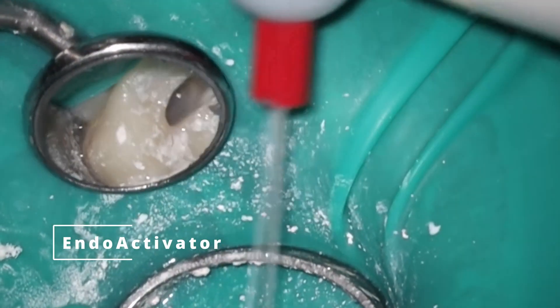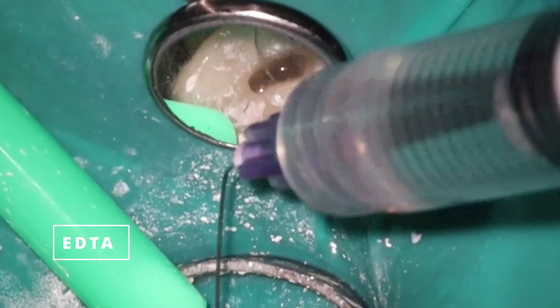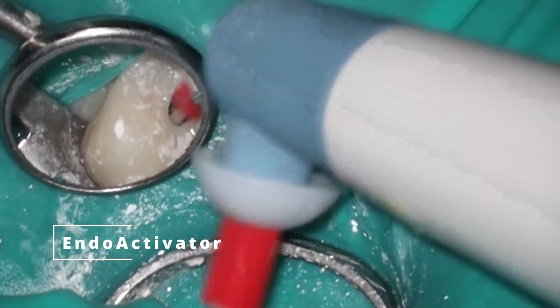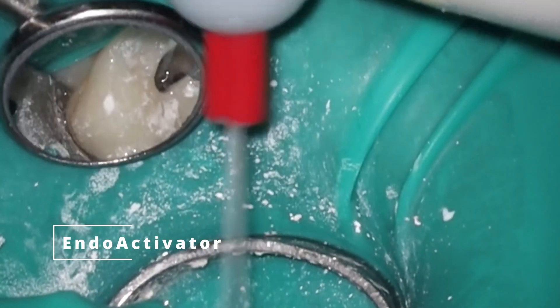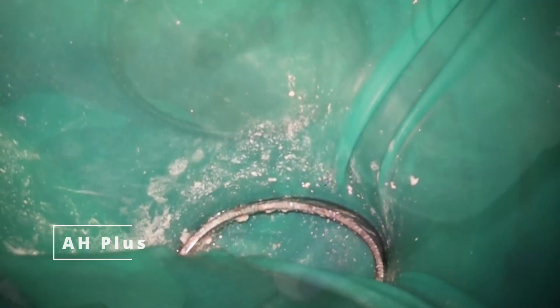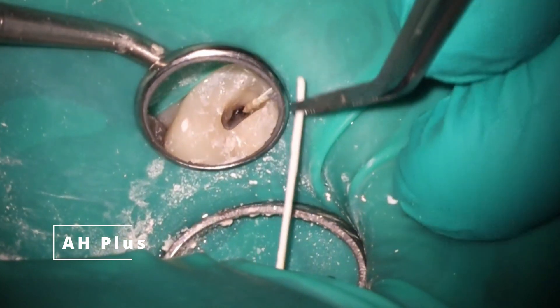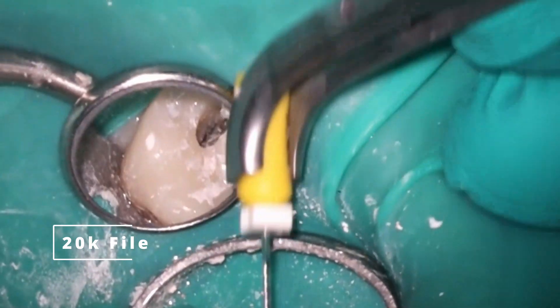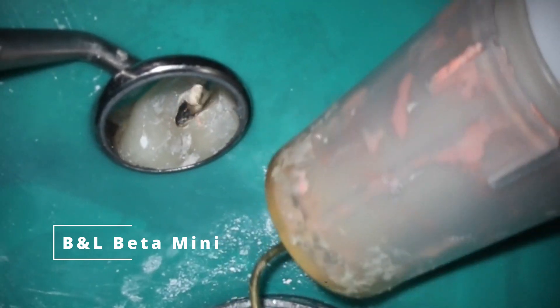So now we're doing our final rinse — bleach, EDTA, and then isopropyl alcohol. I'm rinsing until I don't see any materials coming up anymore, whether that be gutta percha or debris. You shouldn't see any junk at this point because the calcium hydroxide did its job. Then we go ahead and seal this case up. I'm going to use the squirt technique for this one. I'm not really worried about overfill here because we had the whole month to heal up and we have a pretty solid stop — you'll see in the final there's a little sealer puff but nothing excessive.